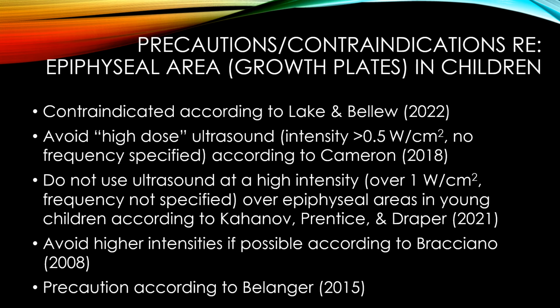Another area where there's some disagreement or discussion, I guess, would be epiphyseal areas or growth plates in children who are not yet skeletally mature. According to Lake and Bellew, therapeutic ultrasound is simply contraindicated over growth plates. According to Cameron, we want to avoid high-dose ultrasound, and Cameron defines high dose for this particular situation as greater than 0.5 watts per square centimeter, but didn't specify the frequency, which of course has a big effect on the heating effect.